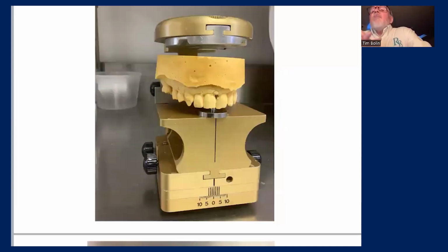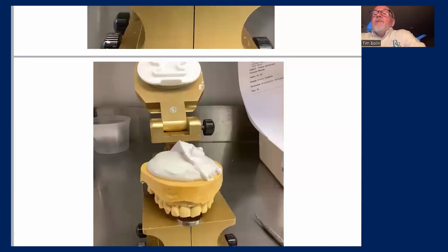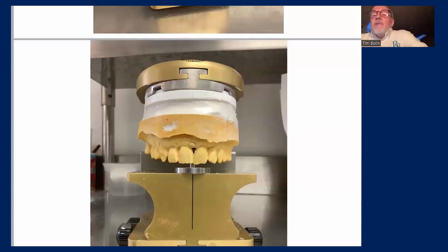Now, as we set this up with everything as it is, the upper model is a little bit too tall to fit on the Acculiner at MP with our base plate or our mounting plate in the upper member. I simply took it over, gave myself a little bit more room. There we got the upper mounting plate in position over the upper model. Mounting plaster is added, close the Acculiner down. Same as before, we don't deviate in our mountings. Just making sure that that anterior pin is lined up with the center portion of the tabletop.